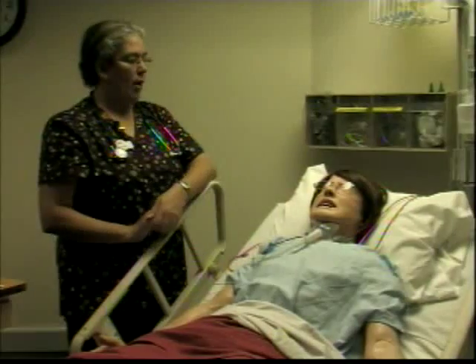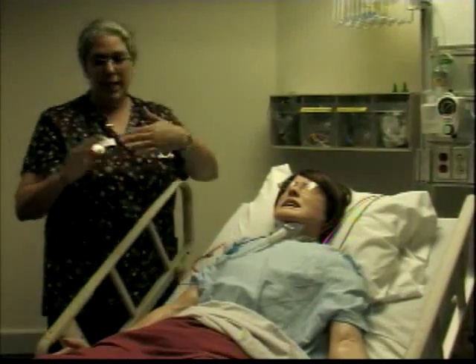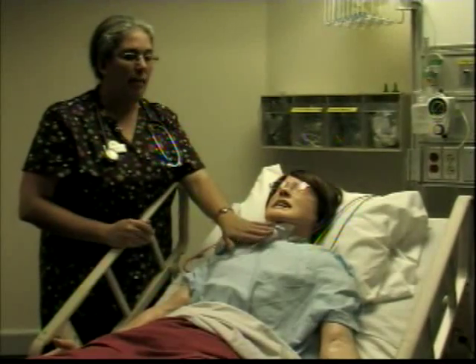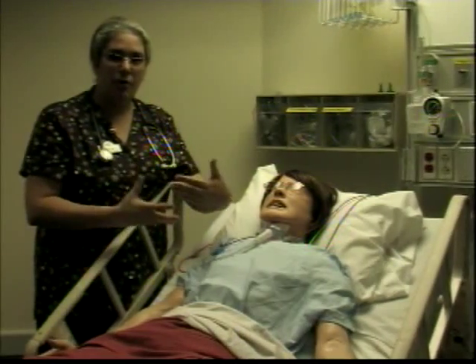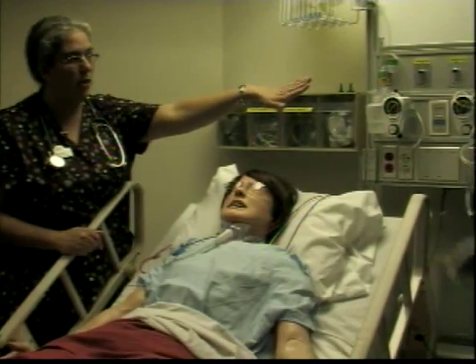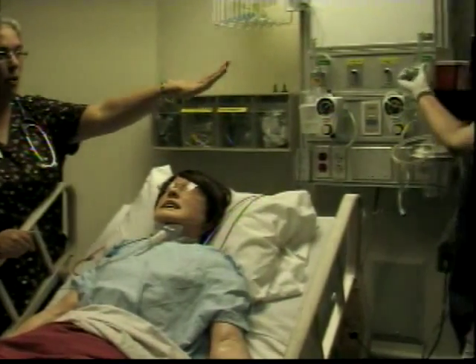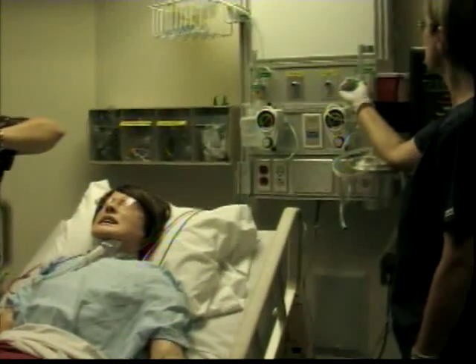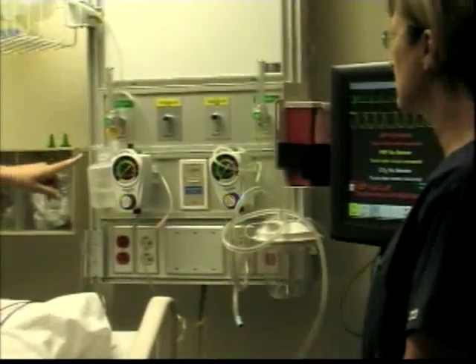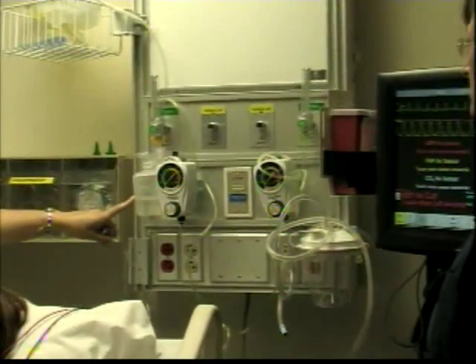One of the other things we want to make sure of is that as I am preparing my equipment, I give her enough oxygen to carry her through the procedure so she's not depleted. I have her connected to the monitor that shows the heart rate and the pulse ox, and I can monitor that. Mrs. Faye is getting the trach collar; she has humidification on her oxygen.